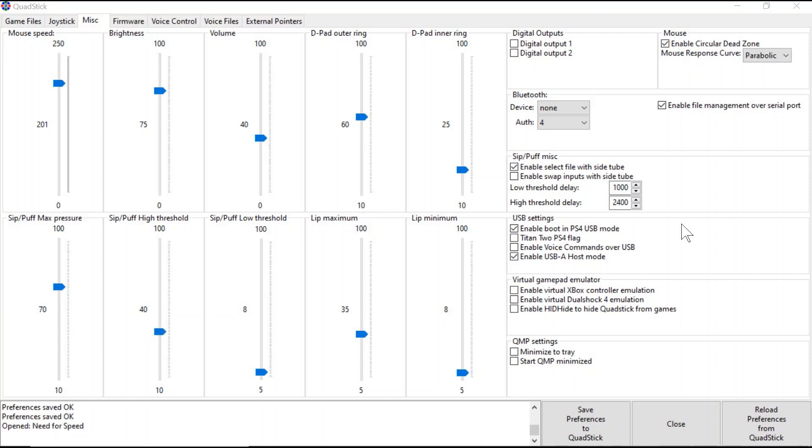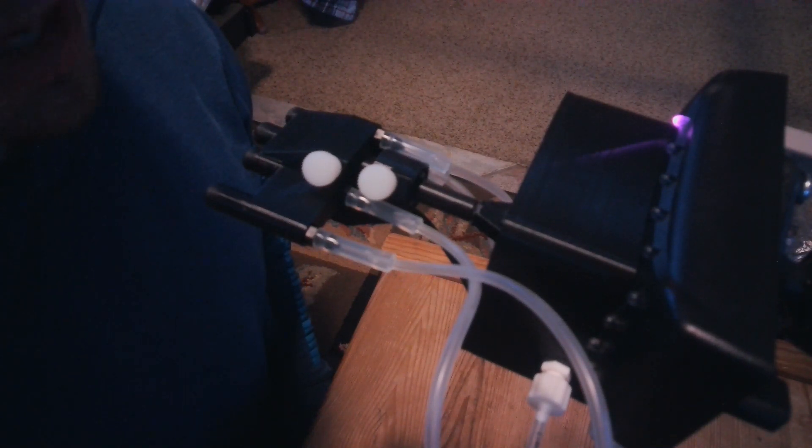Another helpful setting that can be adjusted is the Soft Sip and Soft Puff delay. The standard Soft Sips and Soft Puffs are programmed by default to activate after one second. Therefore the user has to wait one second before they activate in a game. As the user gets more skilled with the Quadstick, they might want these durations shorter so they can activate the Soft Sips and Soft Puffs more quickly to access controls when needed.